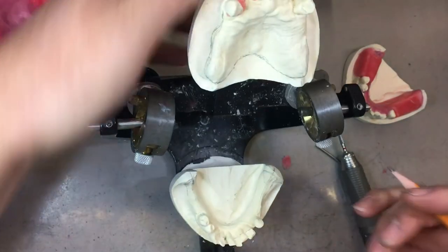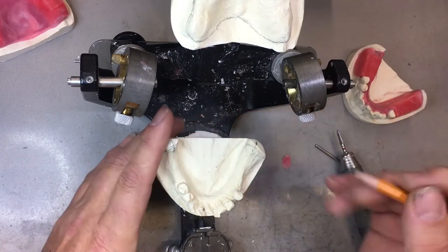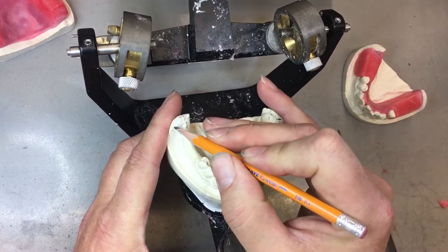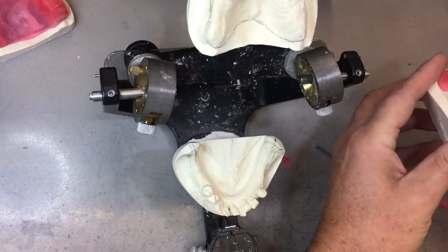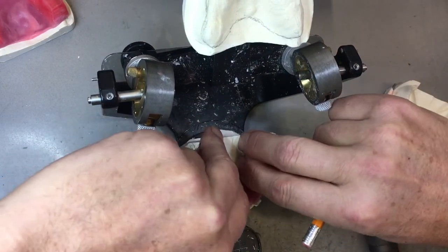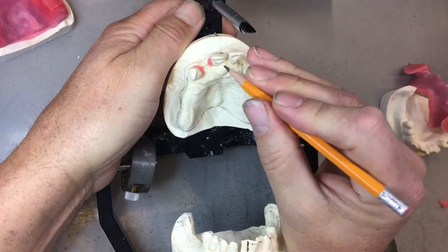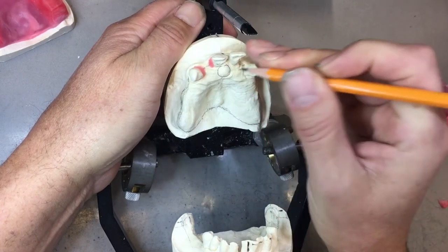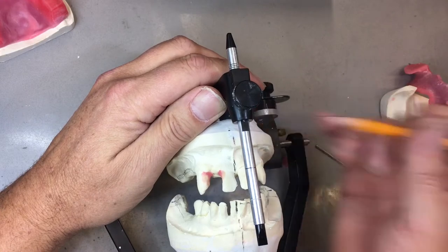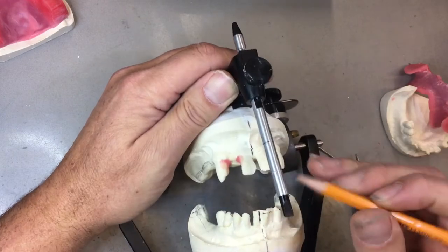What we need to do with our models is some model analysis. Mark the midline of the ridge of the lower. You can outline the retromolar pad — roughly two-thirds retromolar pad as an average value of plane of occlusion — although the practitioner would have created a plane of occlusion with the mandibular occlusion rim. The dentist marked the midline. You can outline this huge incisive papilla. The midline is slightly to the patient's right. You can bring the midline down the model — it's a little to the left.